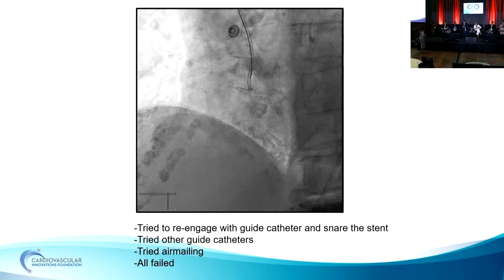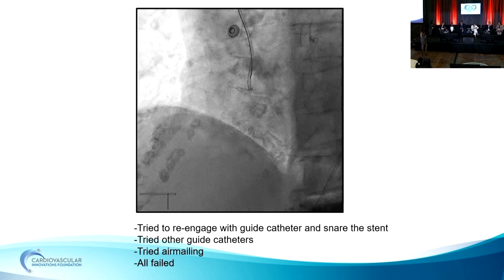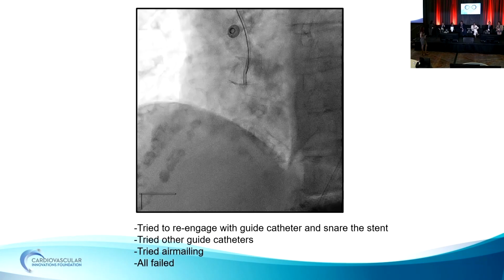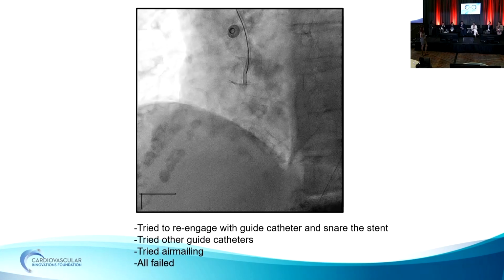Right. But I think now that we're in this situation, the question I'm asking myself is, am I crushing the stent to the wall? Am I leaving it there, or am I going to get it out somehow? I think, given the anatomic situation, there is some reason for optimism about snaring this and pulling it out. But we'll see how that went. I think that's now the algorithm in my mind.